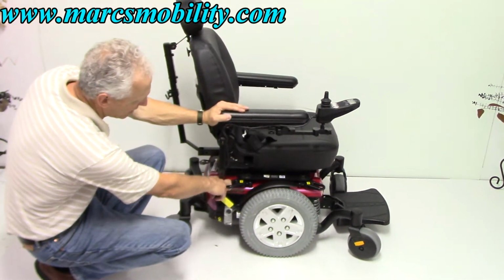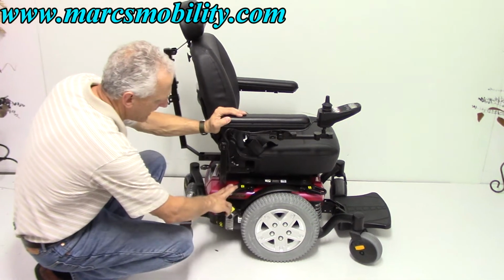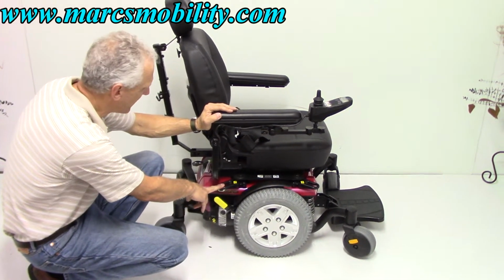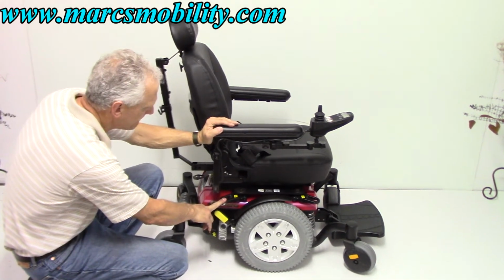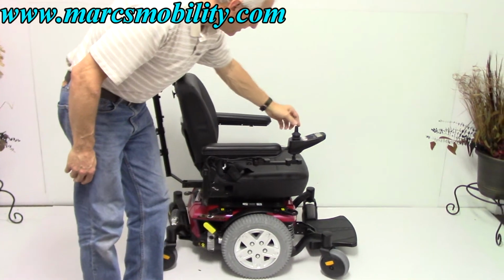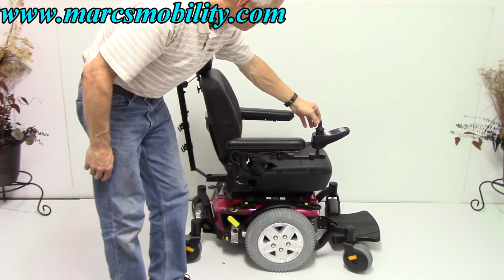You have solid anchor points here and here. They're tied to the frame. So if you need to tie your chair to your lift or to your van, right here is where you would hook them up. The nice thing about this chair is that, I'm going to turn the power back on.